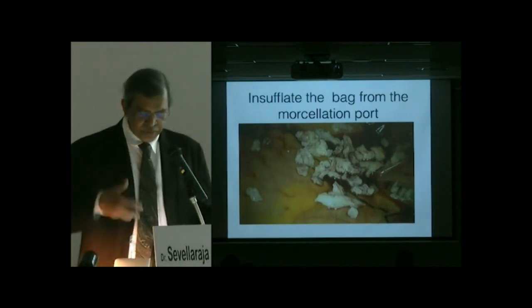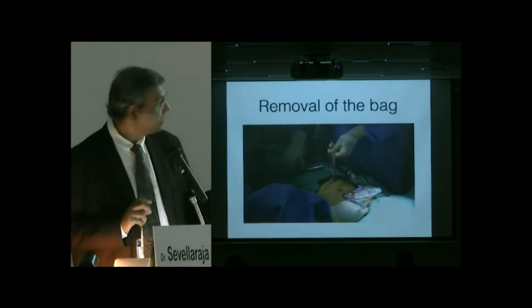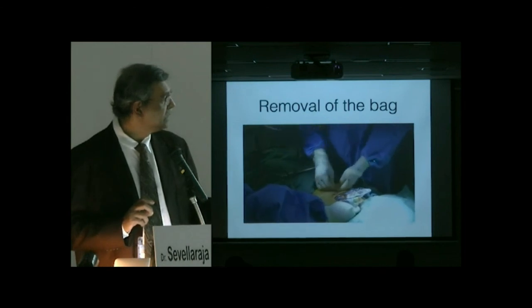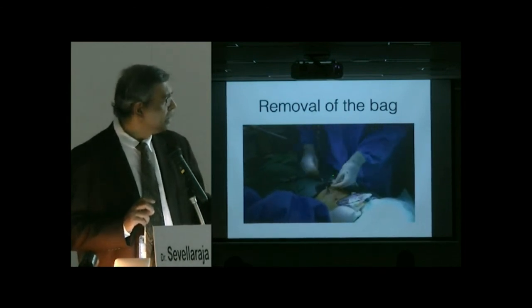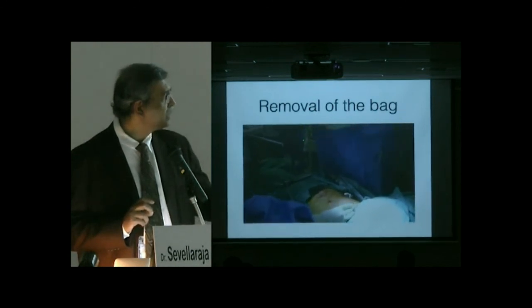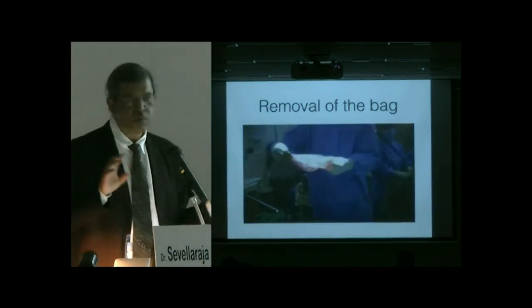The final step is removing the bag. Simply tie a knot below the opening of the bag so that all tissue is contained, then pull the bag out. All the small tissue pieces come out together with the bag. That is how the whole procedure is done.